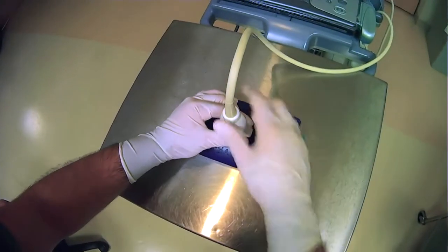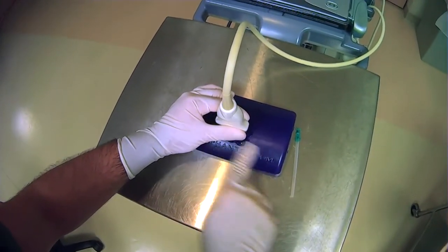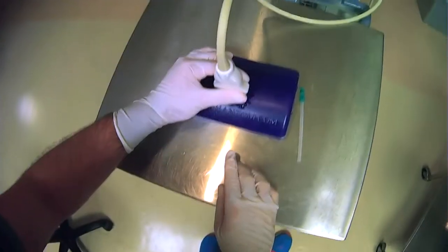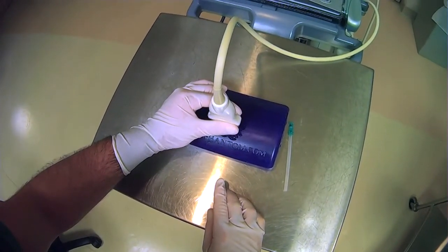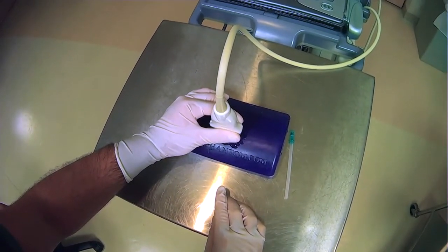So this is one example if you're holding the probe in this orientation where you can hold it in a very stable fashion that is very secure.